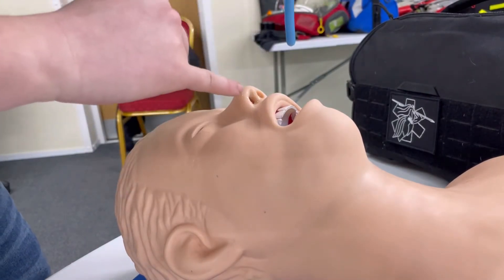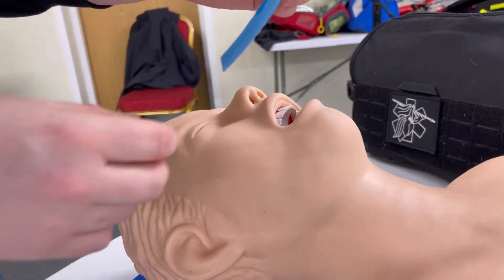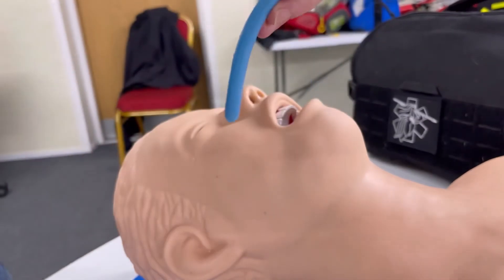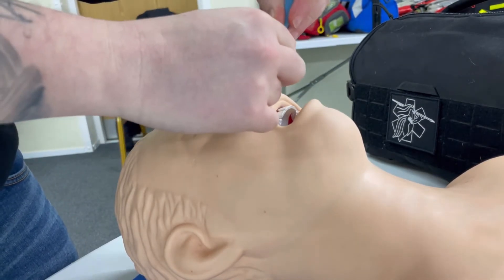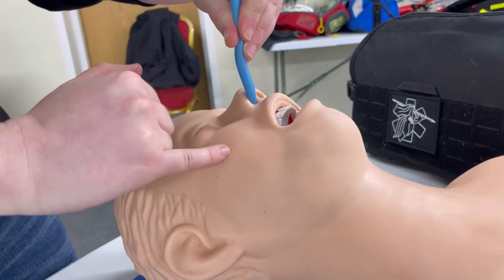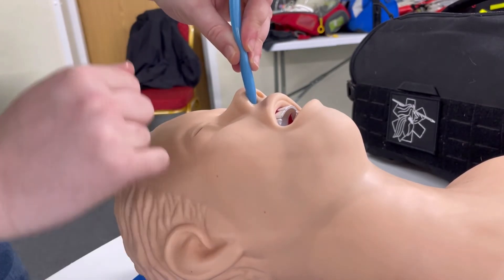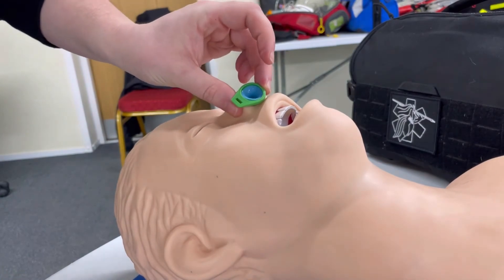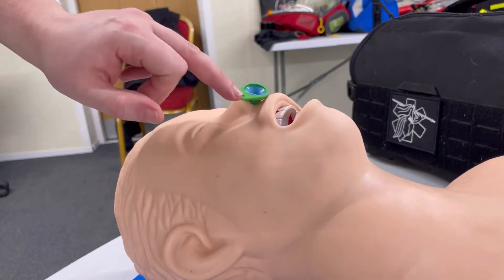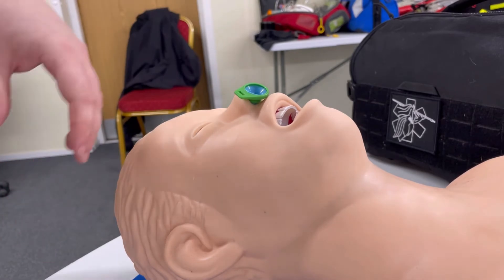We're going to identify our nostril. Generally, just look from the side of the patient and identify which is the bigger looking nostril. If they both look about the same, just pick one. Get the bevel against the septum of the nose — the temptation is to go upwards, thinking that's the direction the nose goes, but it actually goes inwards first, and then once you're in the nasal cavity, your direction of travel is straight backwards, straight down the length of the face. Advance it in a straight line until it's all the way in. Most devices have a flared end that stops it going all the way into the nose — and that's it completely inserted.